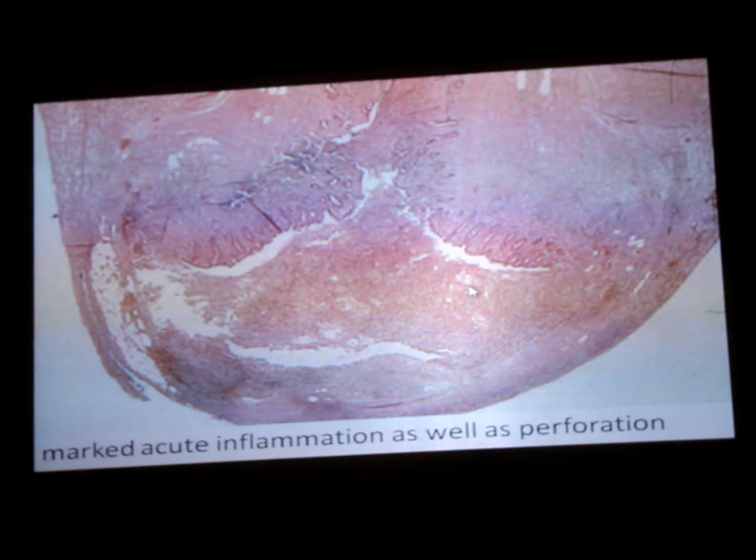Microscopy, what do you see inside this slide? So in acute appendicitis, the mucosa will show ulceration. Ulcerated mucosa is one finding. You won't find these normal glands. You find a lot of inflammatory cells which are filling the mucosa, submucosa, the muscle layer, or up to beyond that, serosa, all the 4 layers.